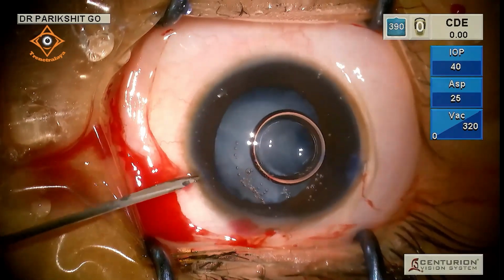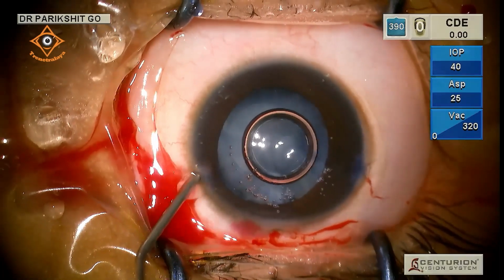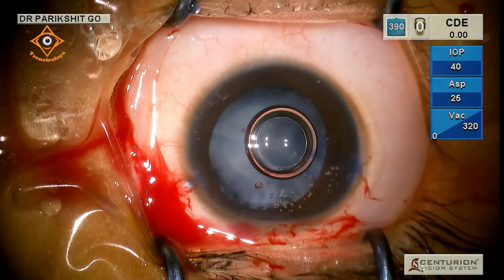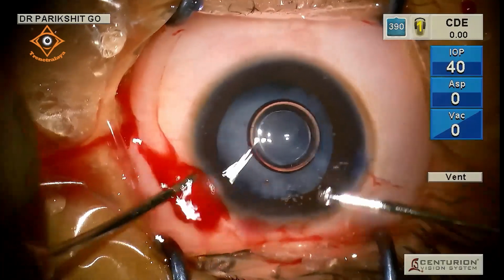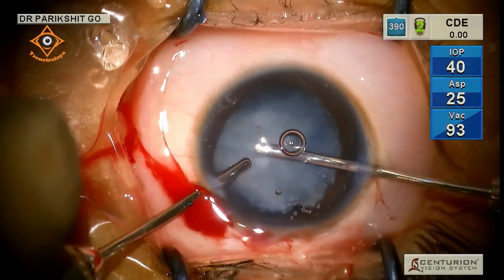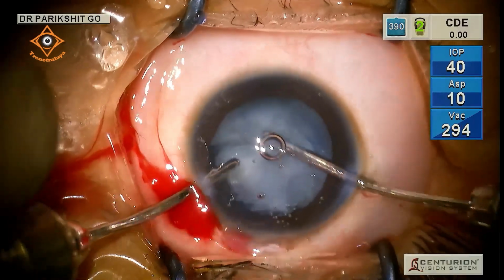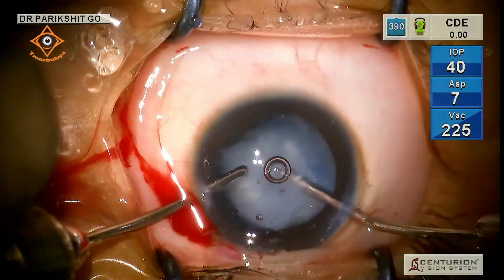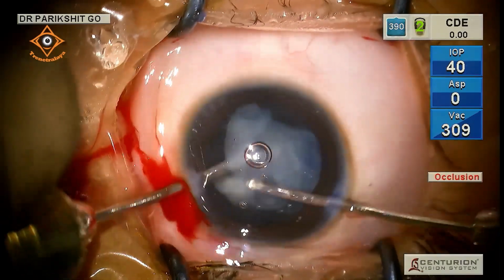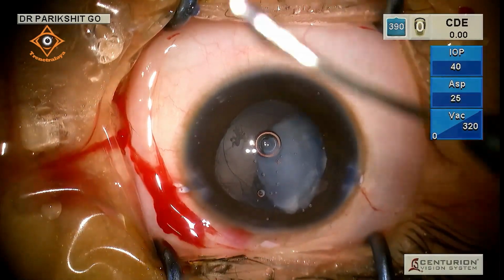Yeah, I think it's just 2 minutes. Also, we had done a study more than 10 years ago, the Miraj Pediatric Cataract Study, in which we looked at almost 7-year follow-up of cataracts operated between 2002-2003 and 2007-2008. Till then, phaco perhaps was not the norm, so some surgeries were done in the conventional way, through manual small incision cataract surgery. I'm a great proponent of manual SICS, but this is one kind of cataract where phaco is definitely the best, because in phaco we can clean and polish the capsules really well, and that gives us the best kind of result in pediatric cataract surgery.